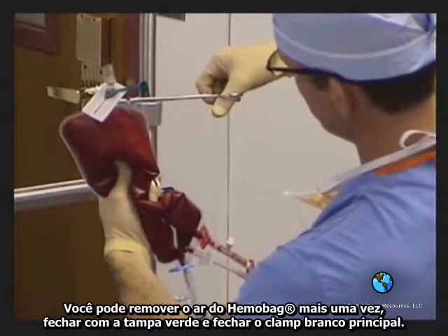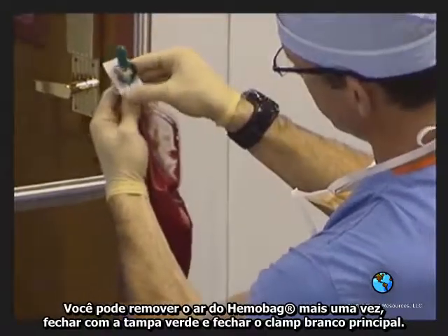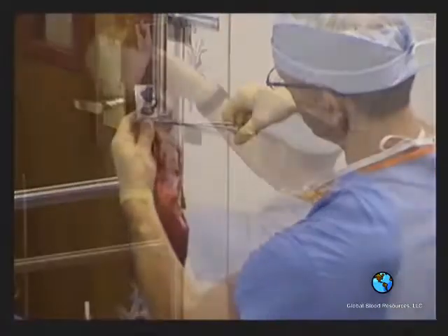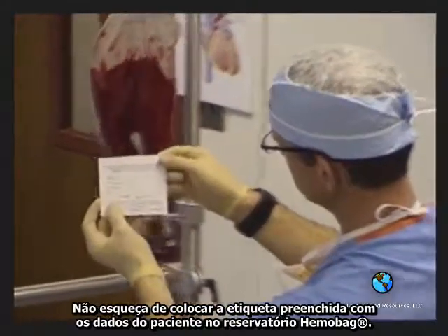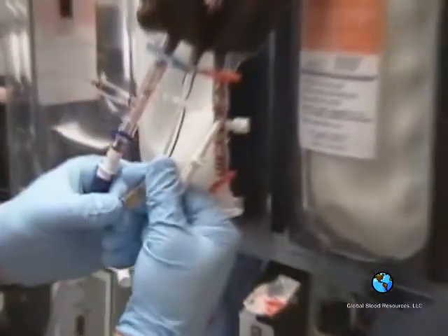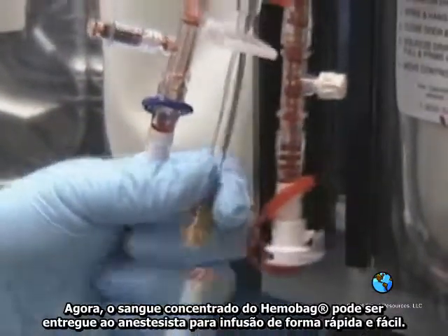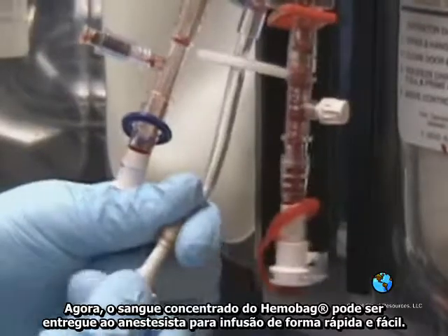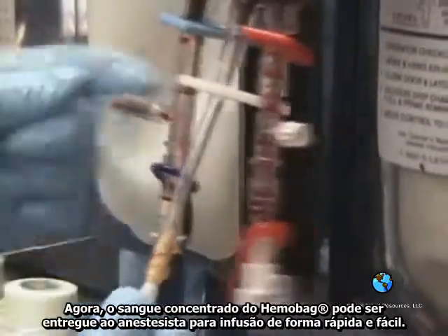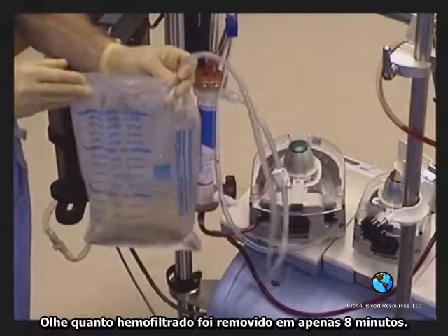The Hemobag can be burped one last time, covered with the green cap and the white slide clamp closed. Don't forget to place the completed patient label on the Hemobag. Now the concentrated Hemobag blood can be given to anesthesia to spike for quick and easy reinfusion. Look at how much effluent was removed in just 8 minutes.